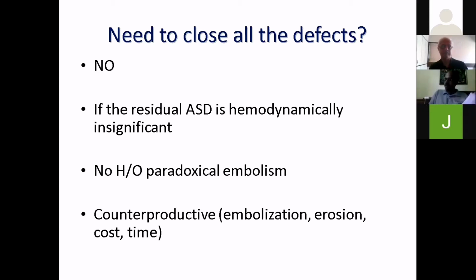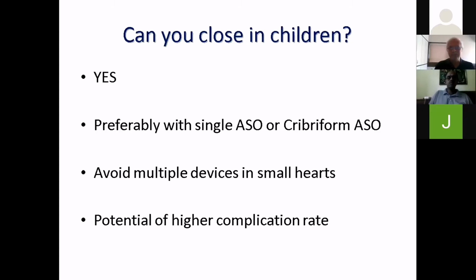The second question, can you close multifenestrated defects in children or multiple defects in children? Answer is of course yes.